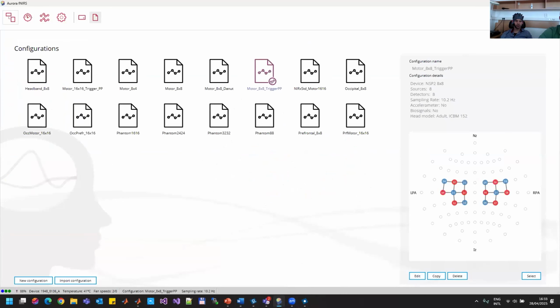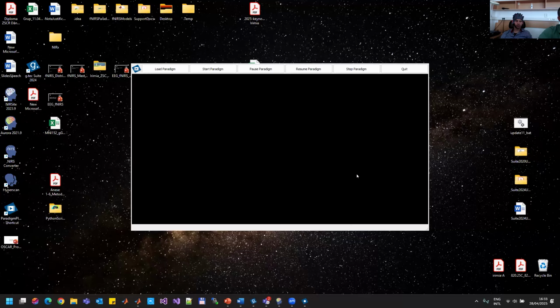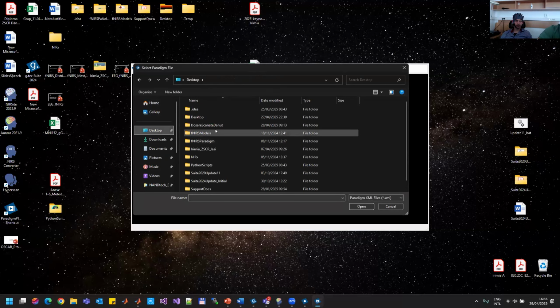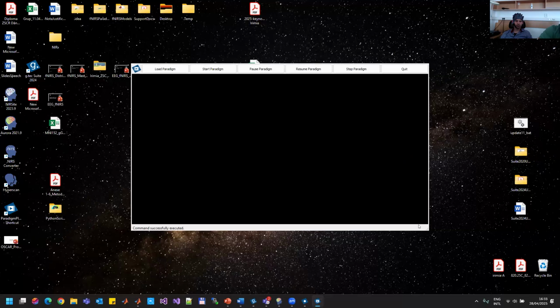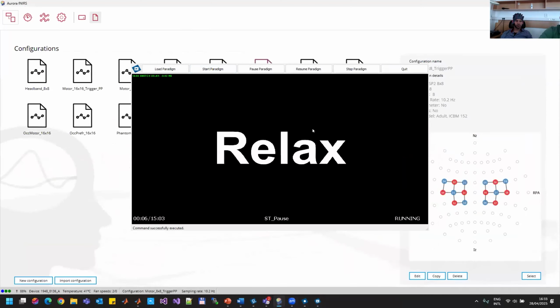Oh, sorry. And I will load the paradigm. Let's say it's on desktop. fNIRS paradigm, motor imagery. Okay, so I will start it for the moment so we can receive everything on Aurora.